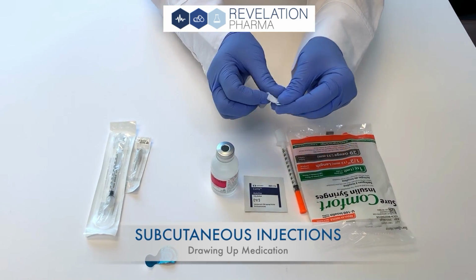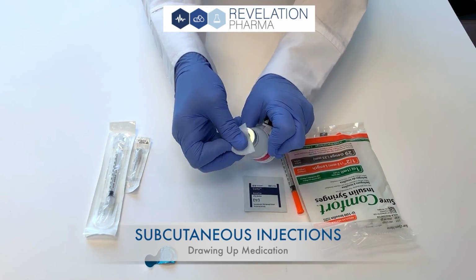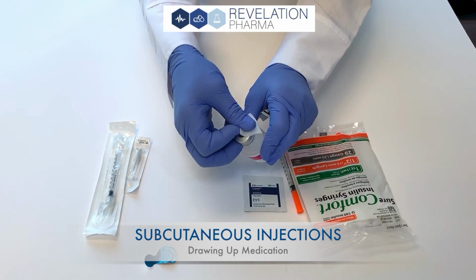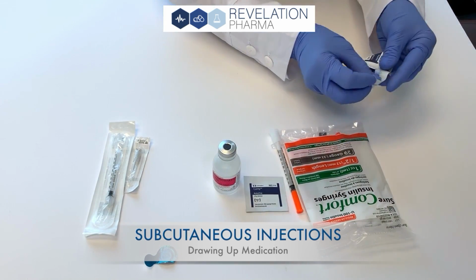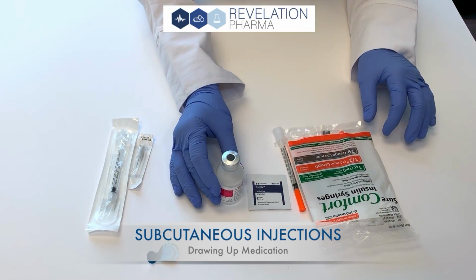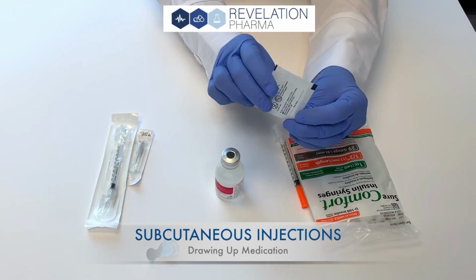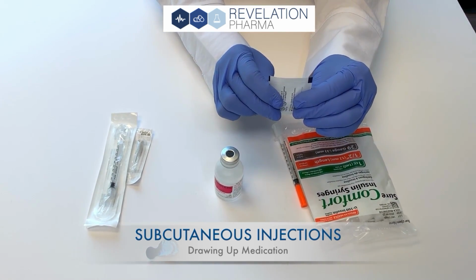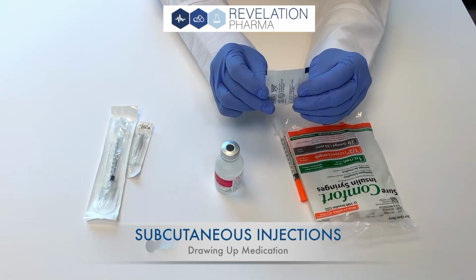At this point, open one alcohol swab and use it to swipe the top of the vial. You want to do this before each injection so as to sterilize the top of the stopper. Let this air dry and do not touch the top of the vial with your fingers. Use a second clean alcohol swab to clean off the exact area on the body to be injected into. Let that area air dry.